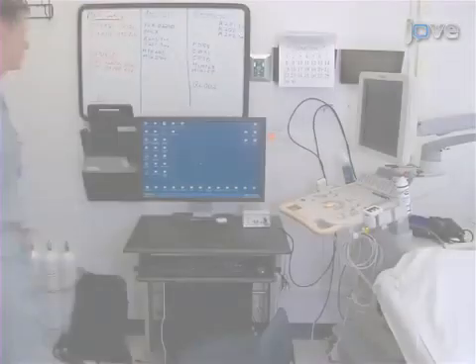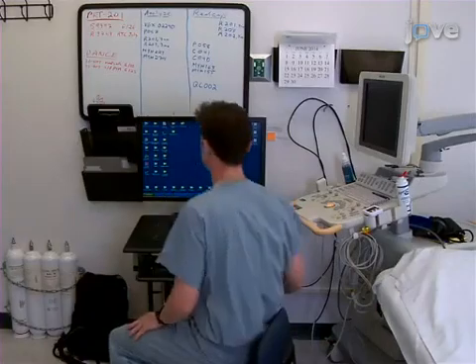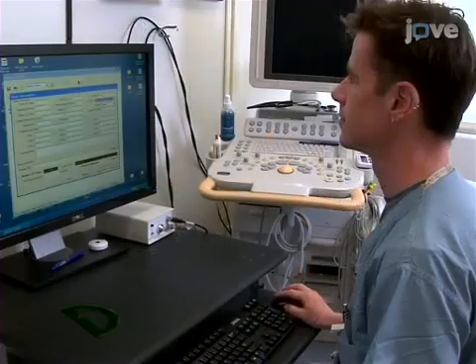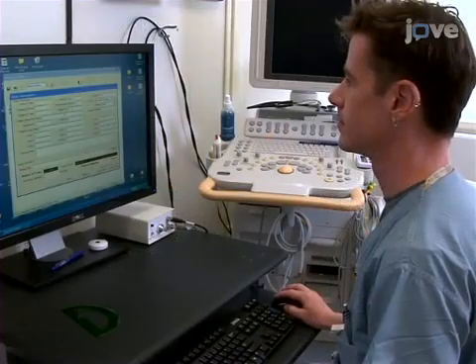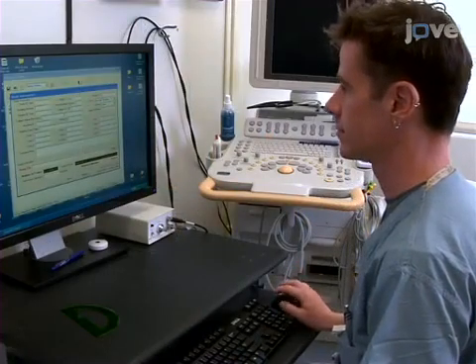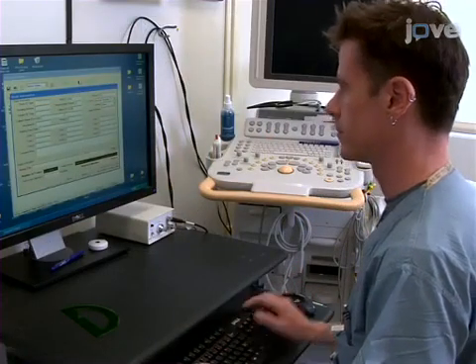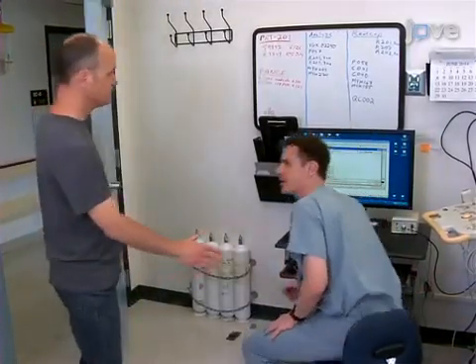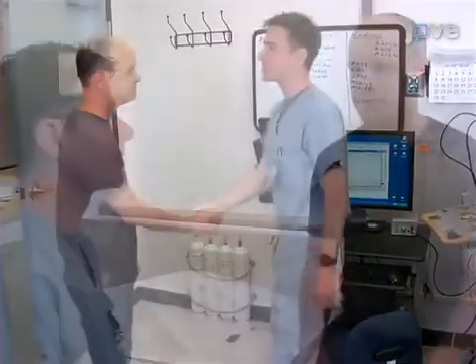To begin, set up an EKG-gated image capture system to record and analyze flow-mediated vasodilation. Conduct the exam in a quiet, darkened room. When conducting longitudinal studies, hold repeat exams at the same time of day.